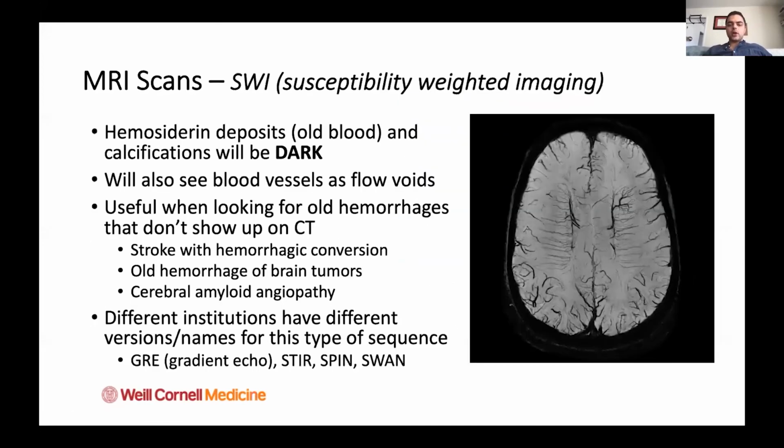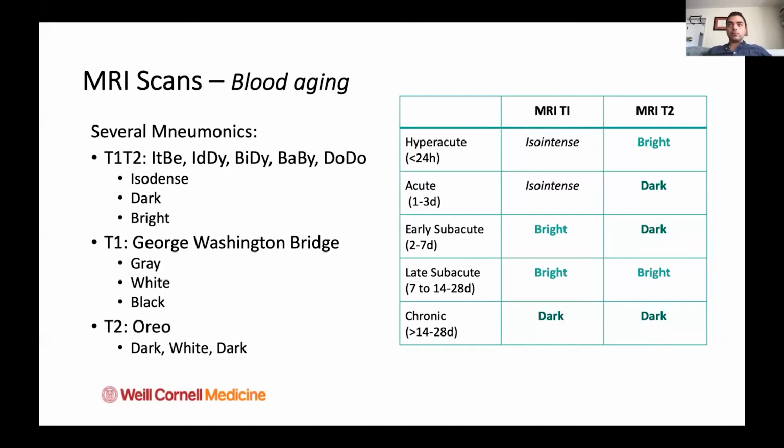As a resident, one of the things that you're going to see a lot of are pre and post-op MRIs for tumor. Okay, and you're going to have to be looking at every single one of those scans in every patient that you take care of and compare what their brain looks like before and after the surgery, before and after the tumor resection. And you're going to have to be looking at the DWIs to identify stroke. You have to look at the T2 and the T2 FLAIR to identify if there's cytotoxic edema, which could happen from venous injury. And you absolutely have to be looking at the pre and post contrast MRI.